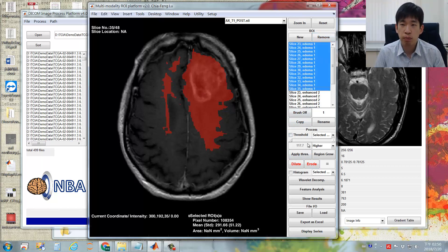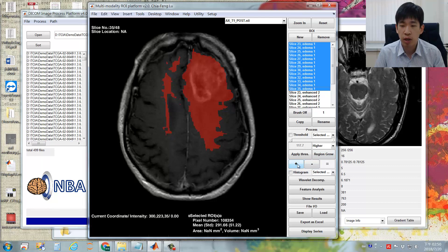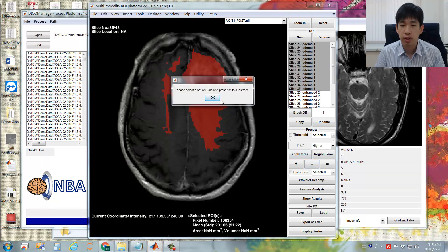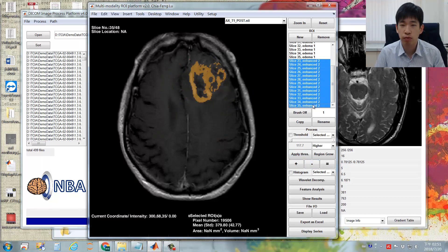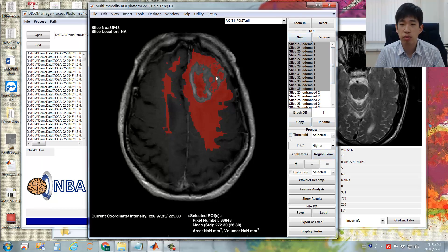You can also perform Boolean operations between ROIs. Deselect the morphology utilities. There is a plus sign for the union of ROIs and a minus sign to exclude specific parts of one ROI from others. For example, to remove the enhanced region from the edema ROIs: first select all the edema ROIs, click the minus button, then select the second set of ROIs you'd like to remove, and click the equals button. The edema regions will then exclude all regions already assigned to the enhanced ROI.